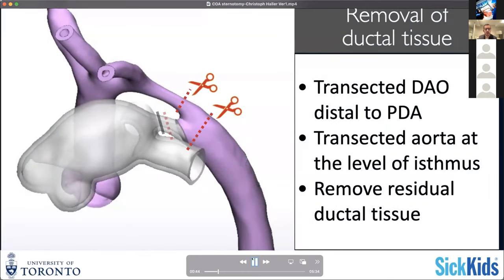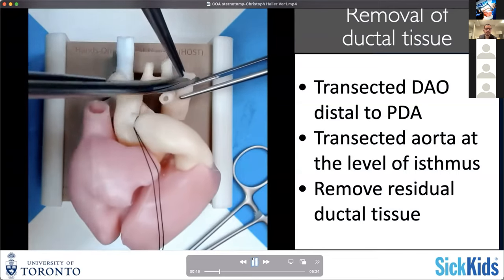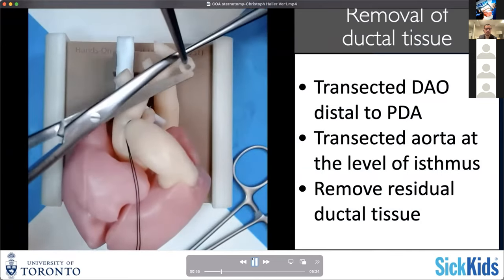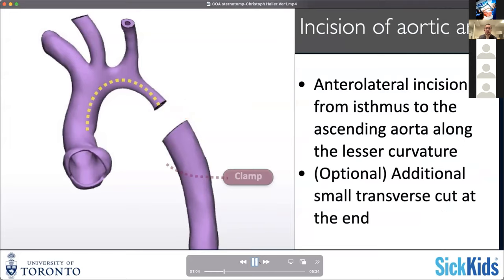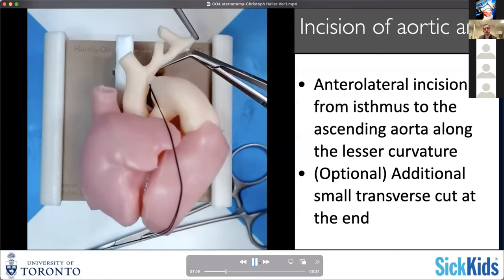There are different options on how to address basically the distal end of your aortic arch. What I've been doing quite frequently is to tie off the distal end - basically suture ligate it - and then do a separate incision in the transverse arch. Here in the model, I've basically divided the ductal area again with resection of suspicious-looking ductal tissue. Then you can incise the aortic arch longitudinally, similar to what you've seen in the thoracotomy extended end-to-end repair.